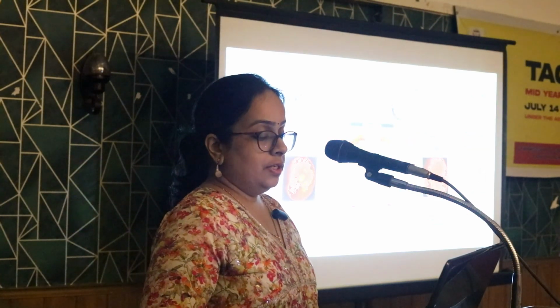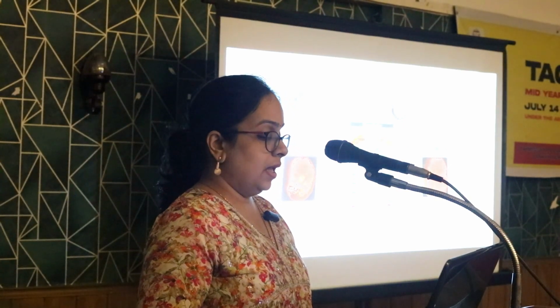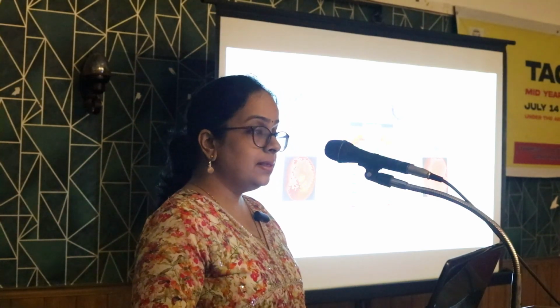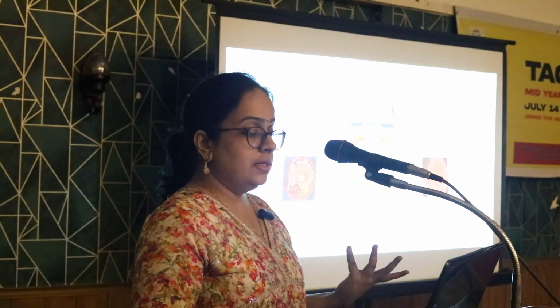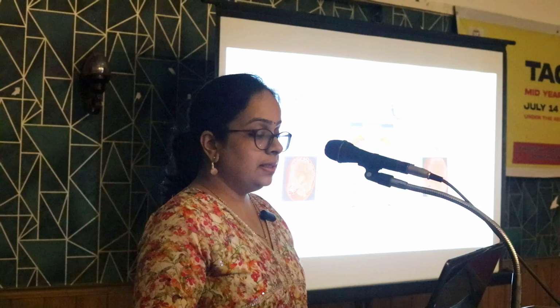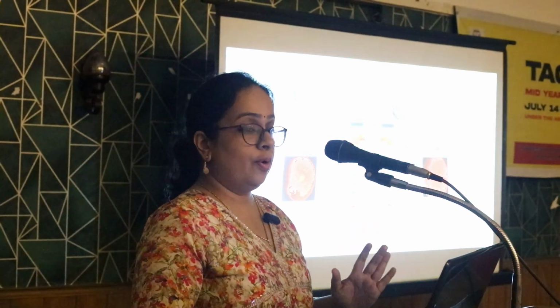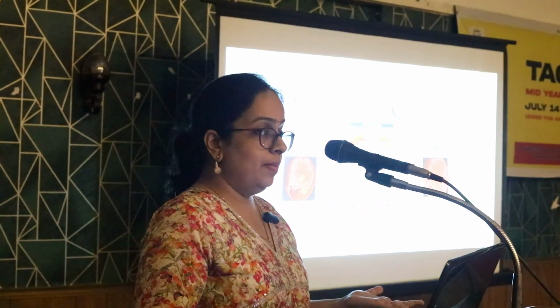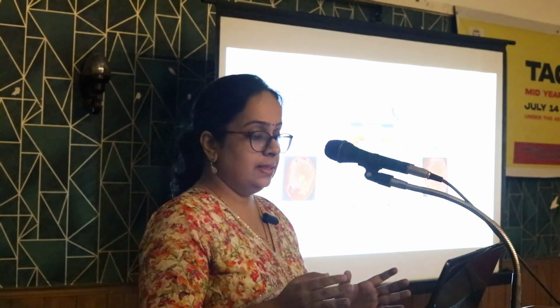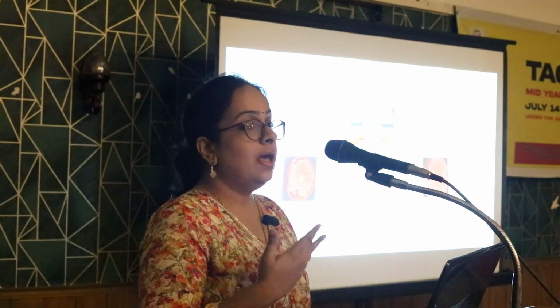There is one more patient, with an RNFL defect in the left eye, and this is the area where there can be a field defect, but the patient is having one more scotoma in this area. This can be an artifact because the patient is not having a defect in the corresponding area. So when we repeat the field in the left eye in this patient, this artifact may disappear. It's important if you analyze progression, because if you take this field as a baseline field, the progression analysis may not be correct. So in these cases, it is better to repeat the field and keep that field as the baseline field and analyze progression.